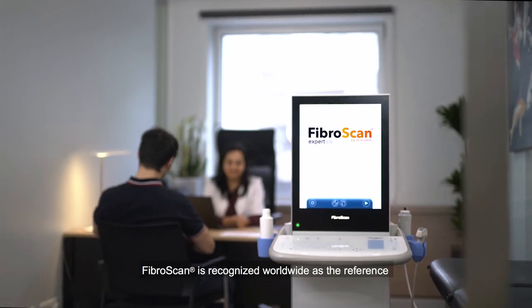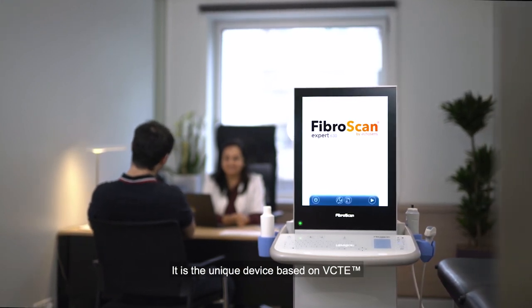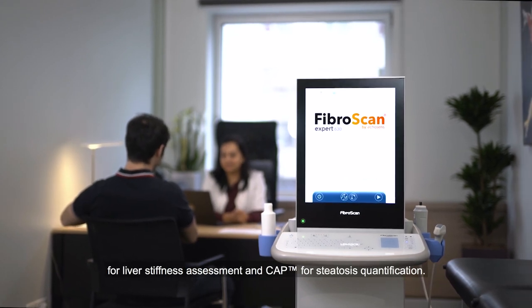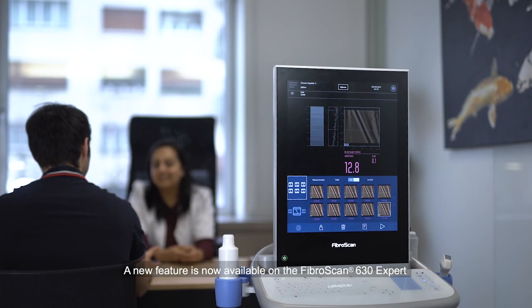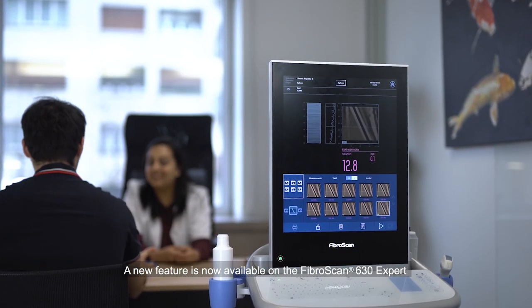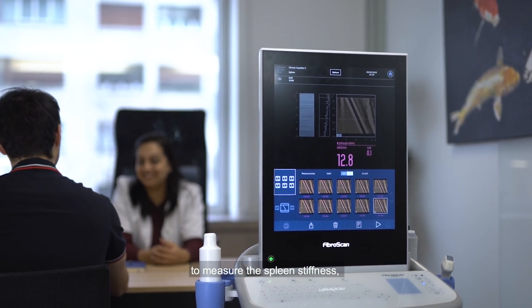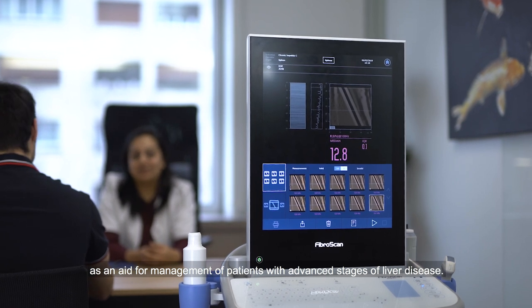FibroScan is recognized worldwide as the reference for non-invasive liver diagnosis. It is the unique device based on VCTE for liver stiffness assessment and CAP for steatosis quantification. A new feature is now available on the FibroScan 630 Expert to measure the spleen stiffness as an aid for management of patients with advanced stages of liver disease.